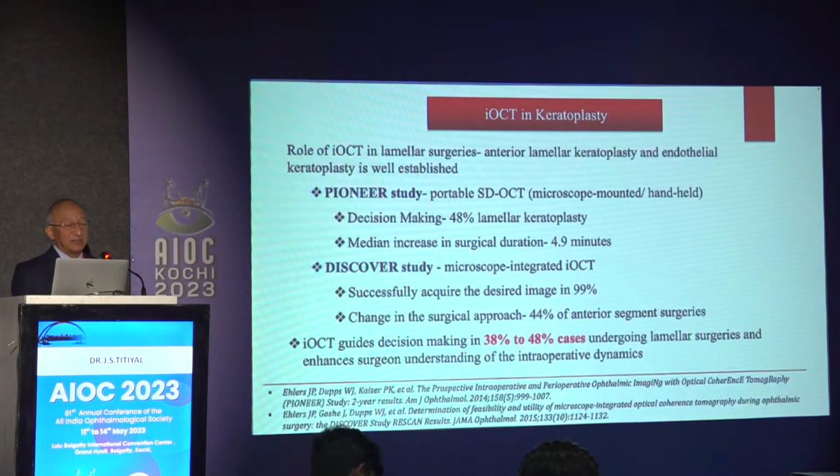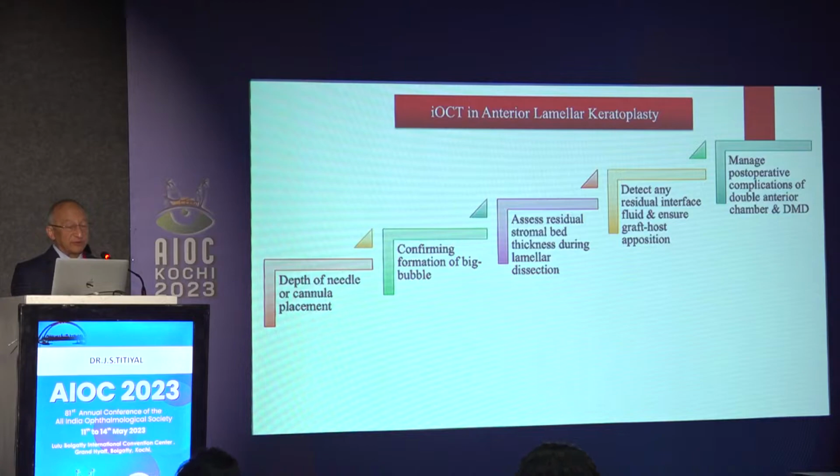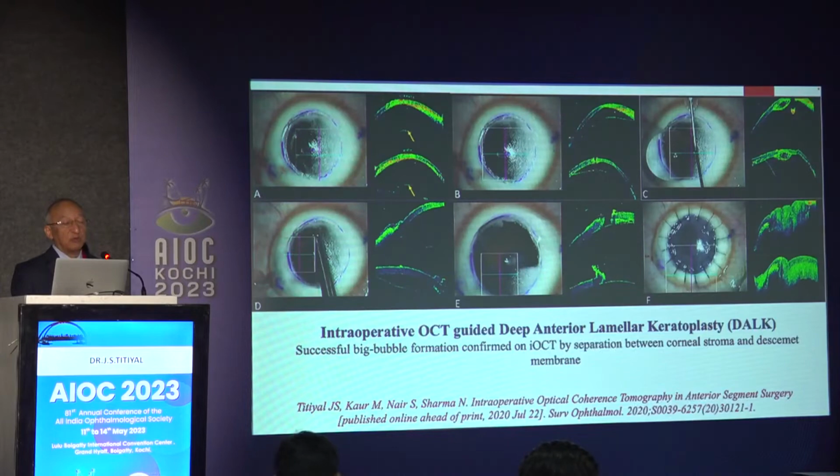Like in keratoplasty, it can be used. In all the studies being done, they found that if you use IOCT, it will change your surgical planning in almost 40% of your cases, which is true for all the steps of surgery. If you're doing DALK or DMEK procedures, right from the initial depth to needle insertion to bubble formation can be seen beautifully in these cases.